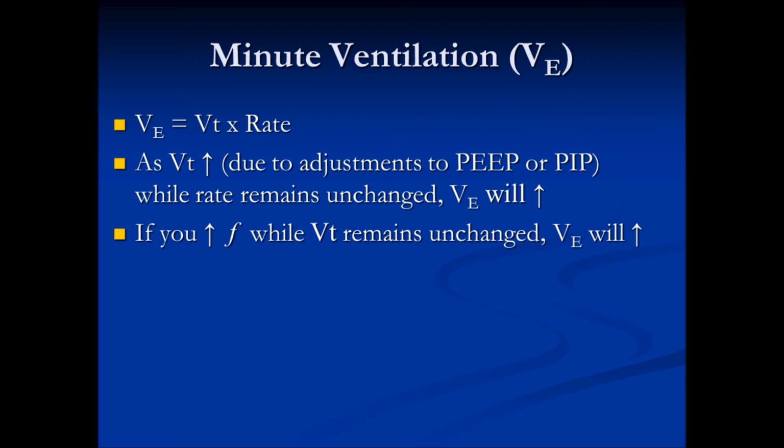So if you increase your rate while tidal volume remains unchanged, so you haven't changed anything regarding PIP or PEEP, but you have changed your rate, then minute ventilation will also go up. Not new information, just revisiting the concepts here.